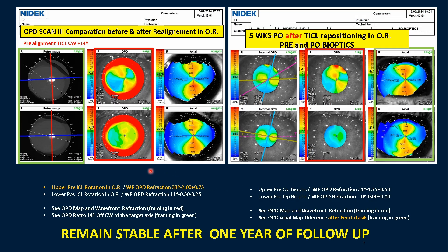Here on the left we see the OPD scan map pre- and post-alignment in the operating room. We see the retroillumination image with the lens hyper-rotated 14 degrees beyond the ideal implantation axis. Below we see the lens already in its ideal position after repositioning in the OR. On the right we see the WaveFront OPD map, showing the mixed astigmatism created by the rotation and its disappearance once placed at the ideal axis, bringing the patient nearly to plano and recovering very good vision.